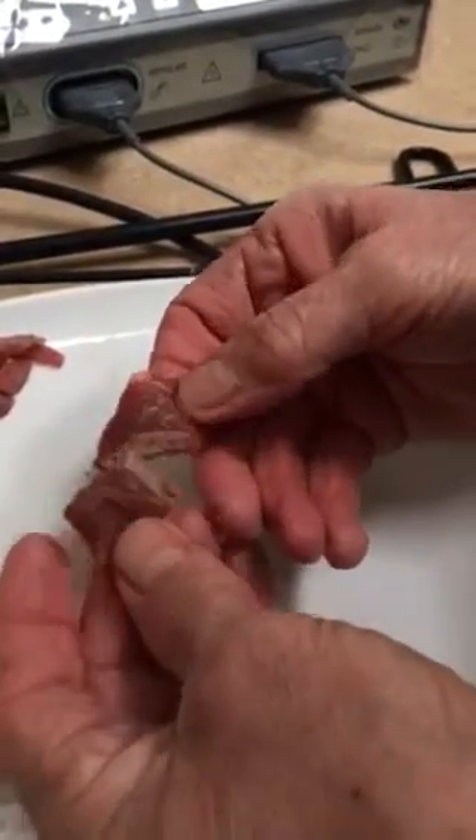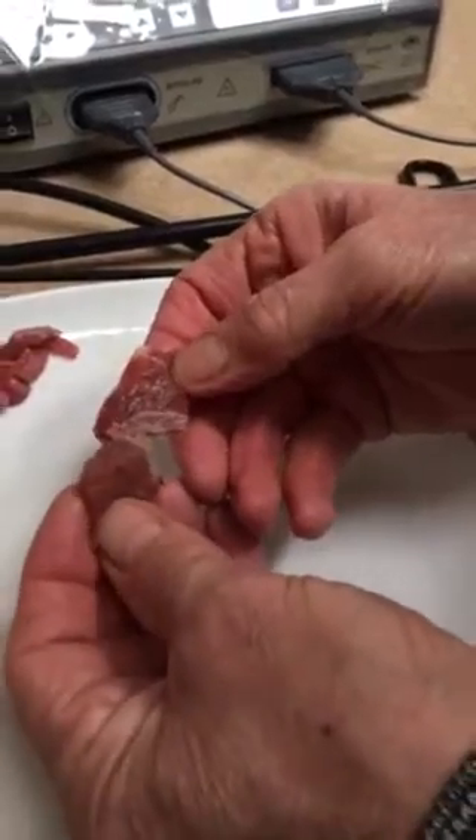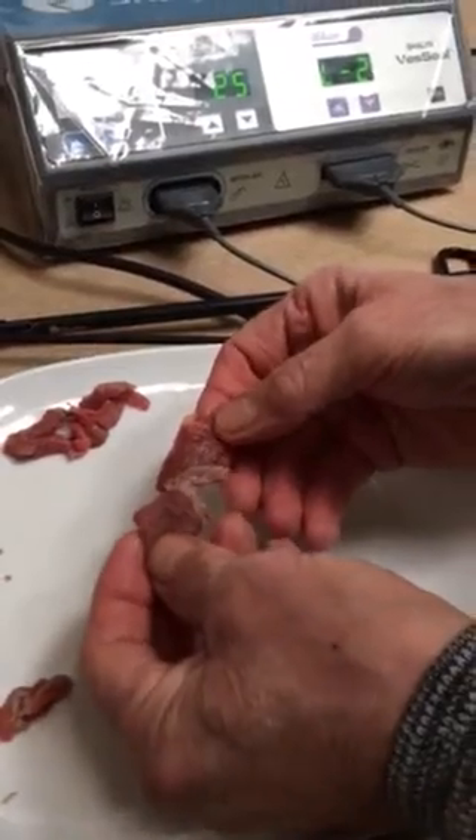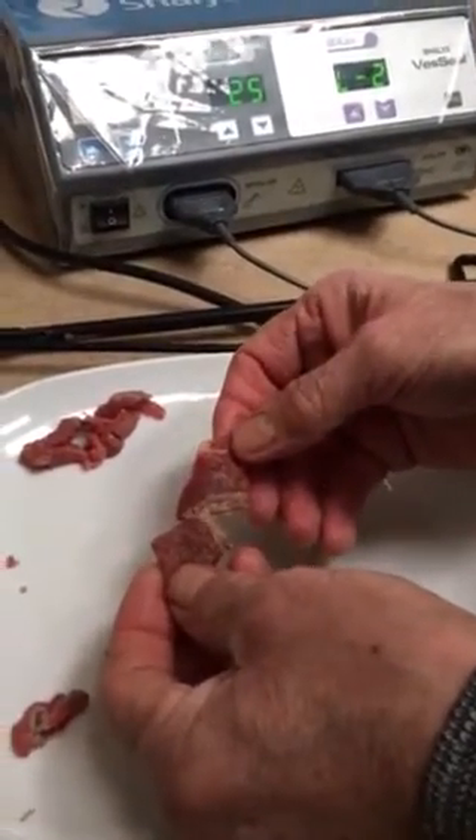The meat's a bit scraggy, so it's not the best of videos to show the actual function of the sealer, but it gives you a very good idea.